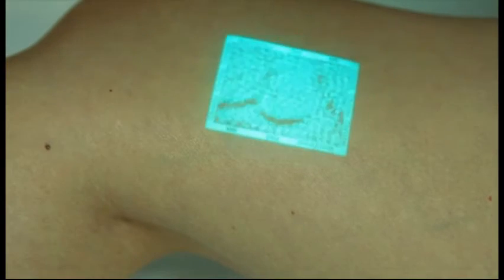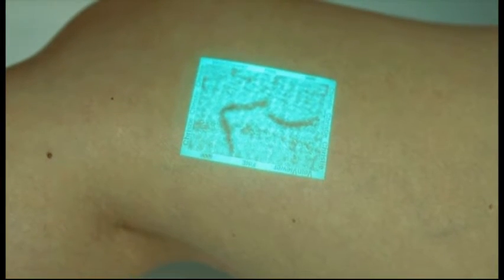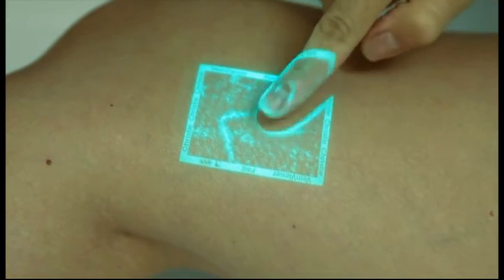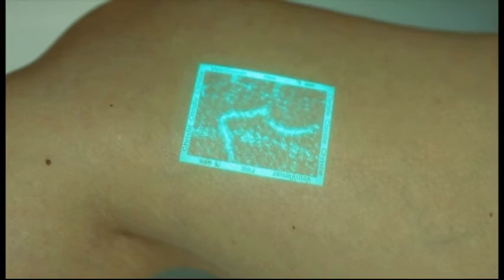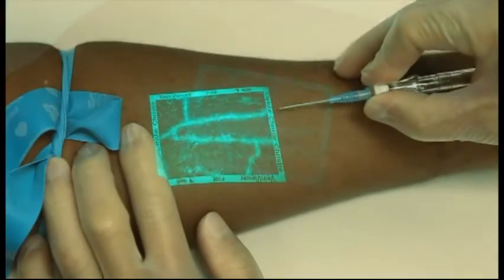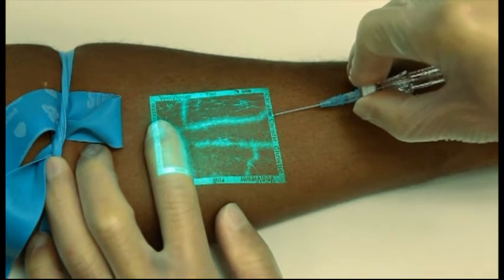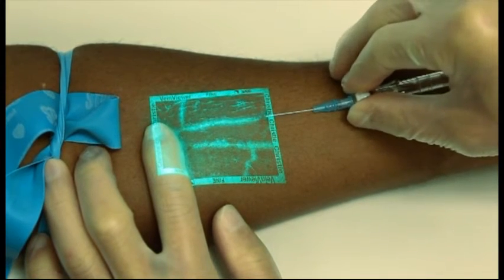The inverse mode reverses the color of the veins and the surrounding tissue inside the image window, switching from our standard dark veins on a green background to green veins on a dark background. This mode is very effective for darker skin tones and any patient where visualizing only the vein image may be of benefit.